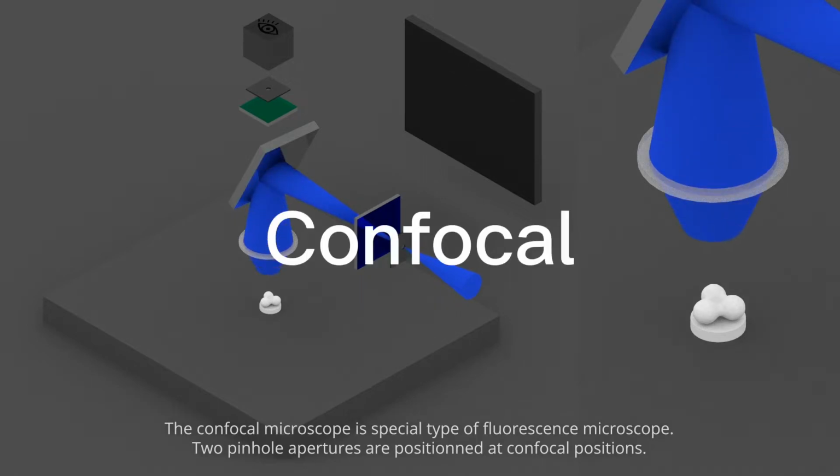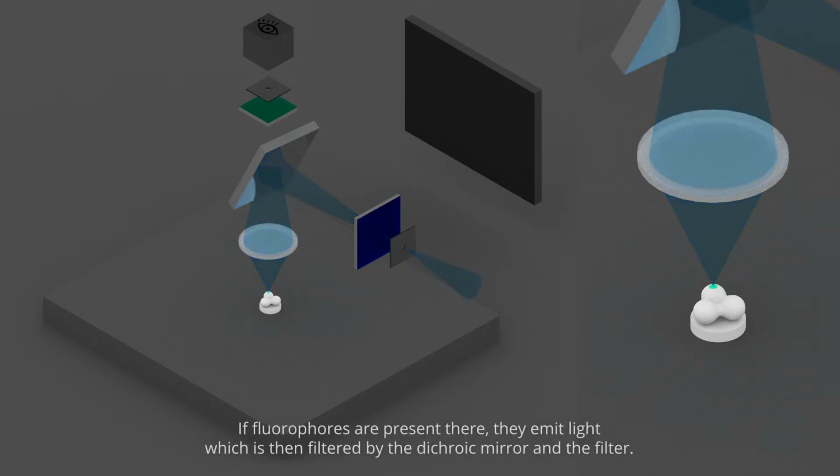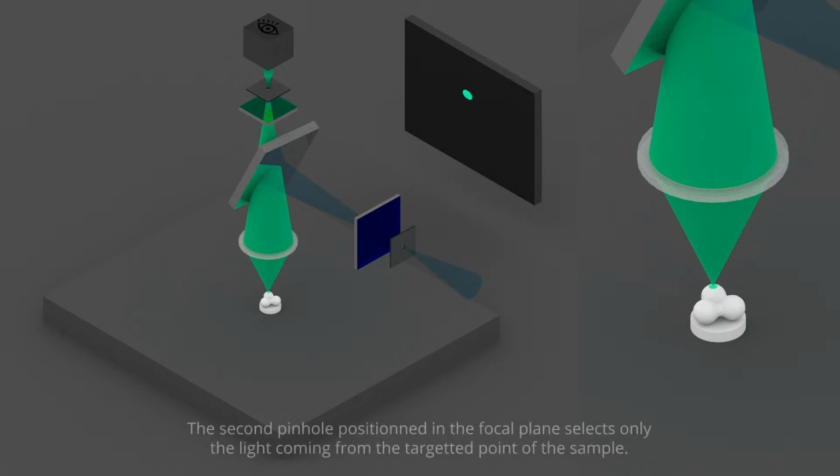Confocal. The so-called confocal means that the emission and reflection light paths are focused at two positions respectively. The light beam emitting light is focused on a point on the surface of the scanned object through the small hole, and then the light reflected by the teeth returns along the optical path, passes through the dichroic mirror and another small hole, and is also focused on the sensor chip.